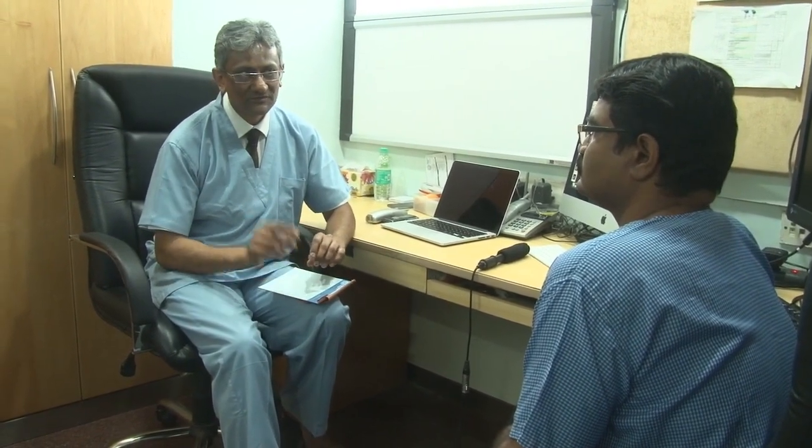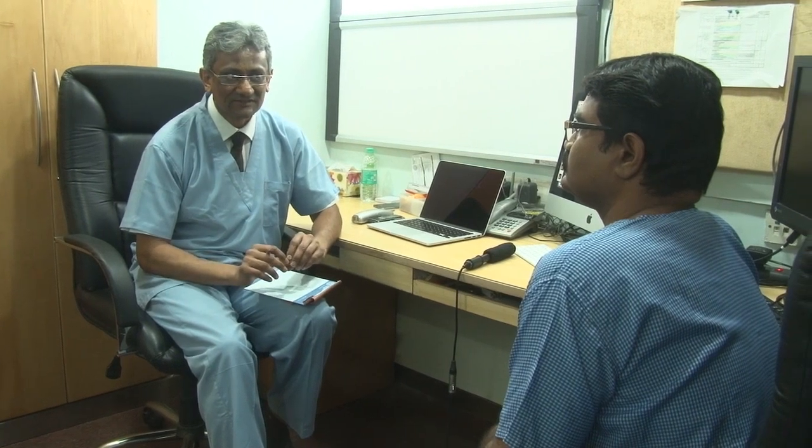When you're inside, whatever happens, please don't move. I do this with millimeter precision in the CT scanner. So if you have any questions, anything comes to mind, talk to me. Three of us will be inside all the time: my anesthetist, intensivist, his name is Rajesh Tarkas, the sister, and I. So don't move your body, turn your head, or move your legs. Just talk to me and we can answer whatever issues there are.